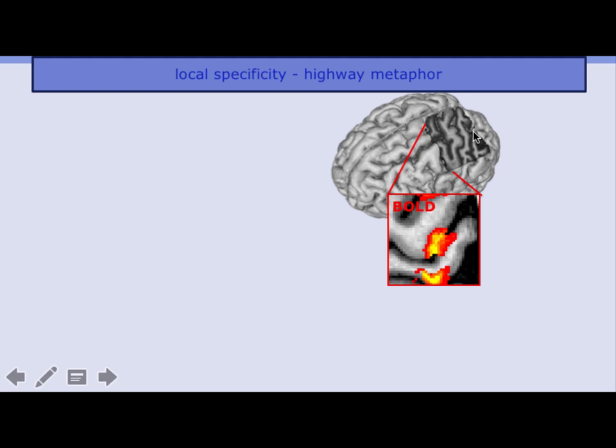Another big challenge of high-resolution fMRI is that the conventional functional contrast mechanisms are not as specific as we want them to be. In fact, if you simply turn up the resolution, you usually end up with the same unspecific blobs, and now you just have them in high resolution.